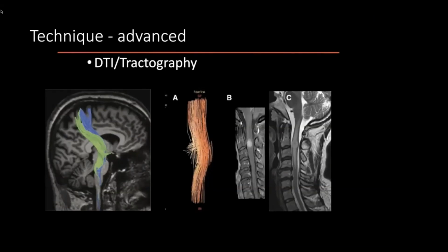Interaction with white matter. Yes, sorry, the question may be confusing you guys because the slide says DTI. DTI stands for diffusion tensor imaging. There are different types of diffusion imaging. More broadly speaking, diffusion imaging is any kind of imaging that will show you the passage or osmosis of water particles, and more importantly, where is that motion of water molecules restricted? A condition we call restricted diffusion.